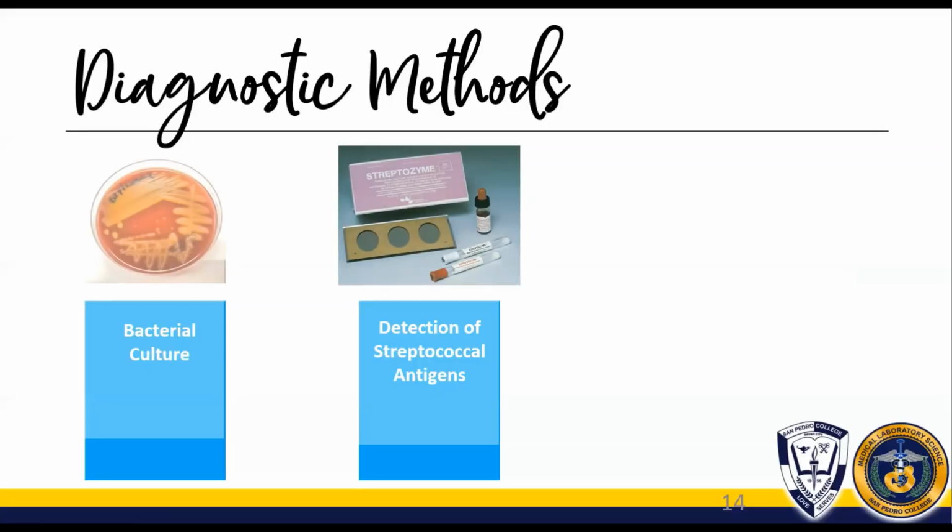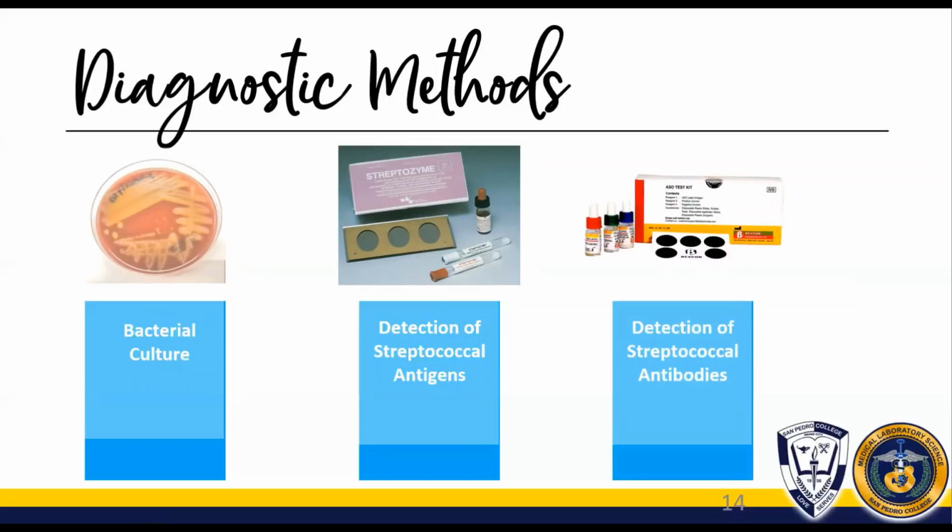Pupunta lang yan sila pag may iba na silang nararamdaman, like sa case ni Maria Clara. So, anong best na gagawin ng doctor? Sa case ni Maria Clara, kasi sabi ni Maria Clara, wala naman daw siyang nagka-sore throat. Wala naman siyang nararamdaman at the moment na pumunta siya sa doctor for a checkup. No? So, what can the doctor do? Yes, the doctor can order a test that will detect streptococcal antibodies.